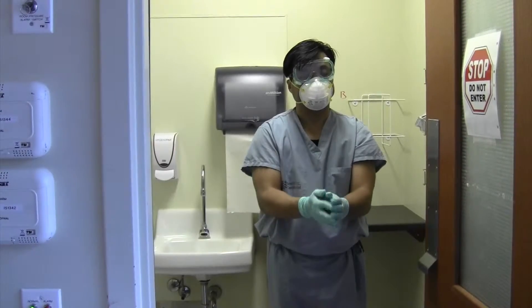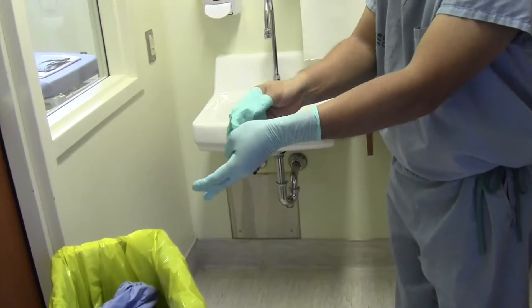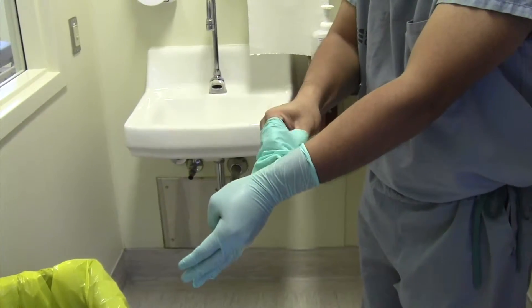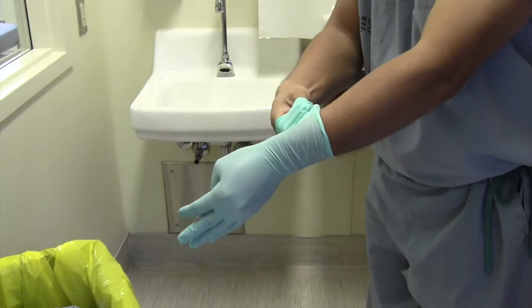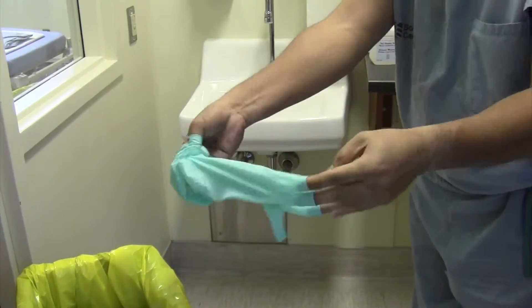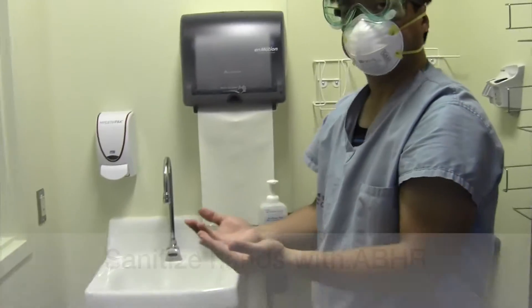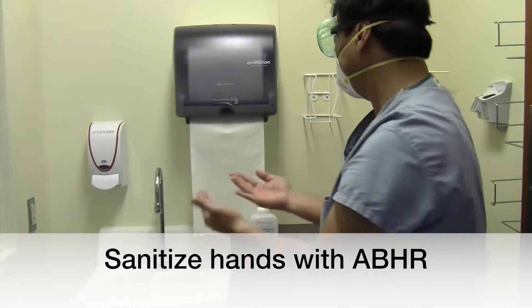Remove your remaining pair of gloves inside out and discard, using the same technique as previously demonstrated — ensuring that you touch only the outside with the outside and inside with the inside, dirty to dirty, clean to clean. Sanitize hands with alcohol-based hand rub.